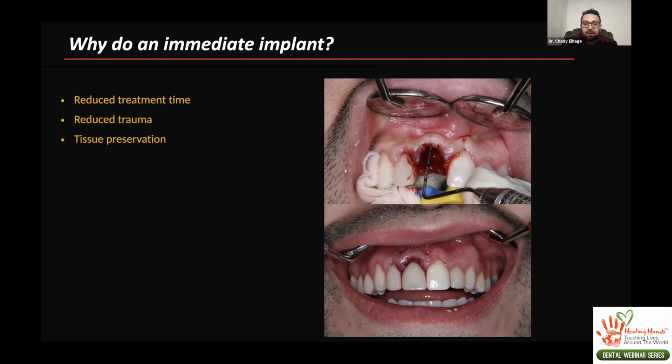For me, one of the very important factors that I take into consideration is where the soft tissues are. You can see on a case like this front tooth, this was an individual who, it's kind of interesting, had crowns placed on the four front teeth. This young man is an orthopedic resident, and during surgery they use hammers and all sorts of hitting and whatnot. They were trying to remove a rod from a knee, and as it came out, the one resident pulled it out and his elbow hit the other young man in the front and just broke the tooth in half.